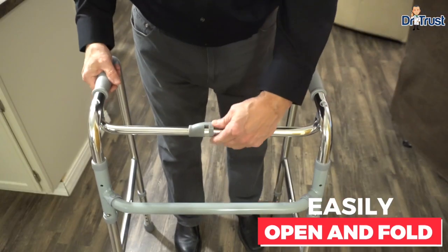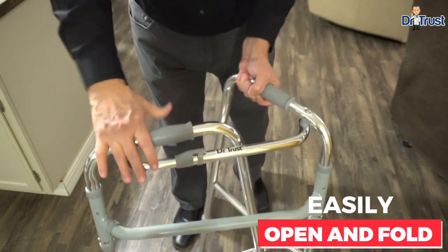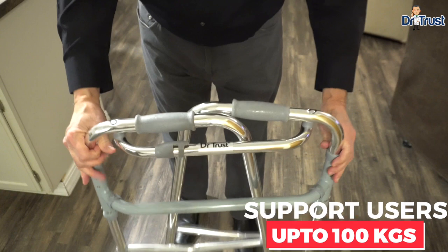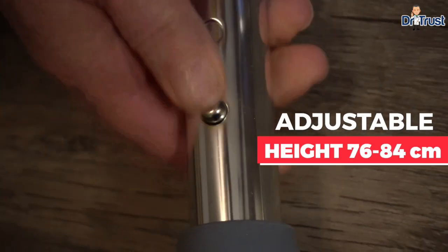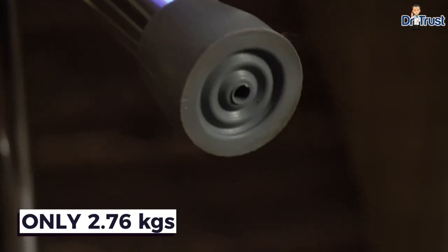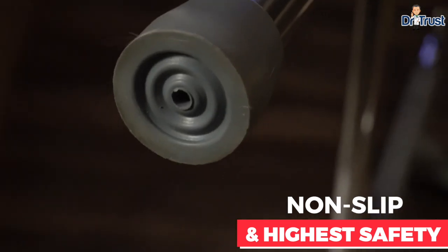Easy open and fold-in design. Ergonomically designed to provide support and assist in maintaining balance while using the Walker. Adjustable anodized aluminum U-shaped frames that are durable and very lightweight. Rubber heel caps provide a strong grip, comfort, and safety on any surface, offering a more relaxed and stable walk for users every time.